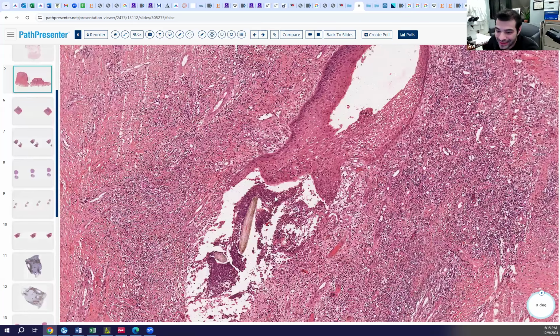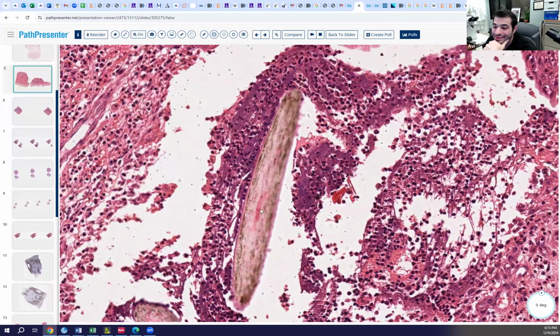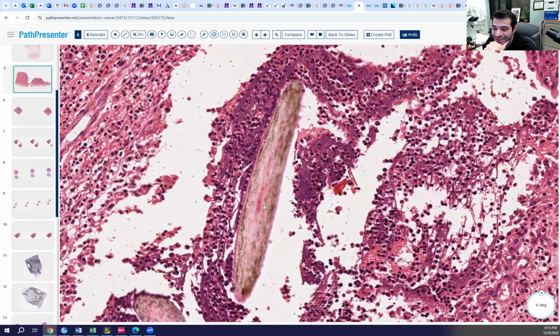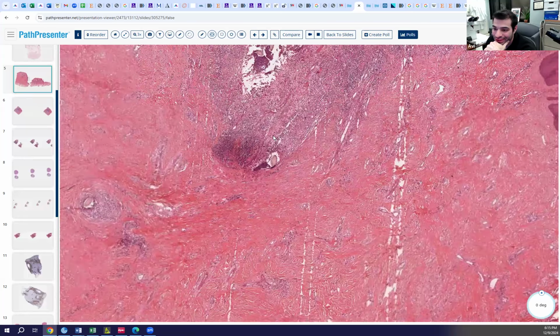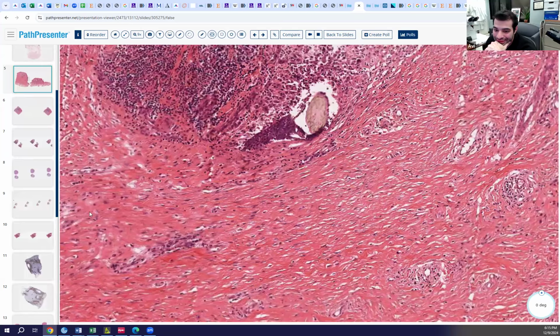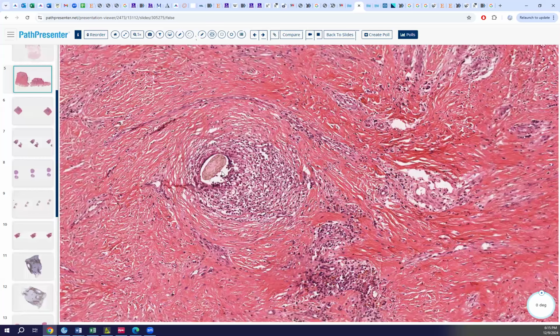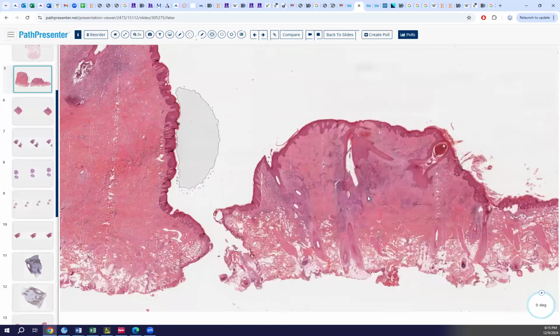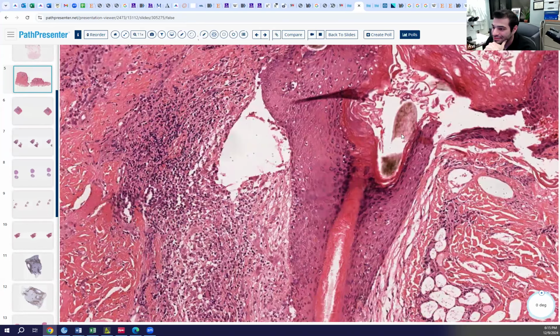Well, a splinter would be plant material. Does this look like plant material, or anything like that? Something you might see that's also here and here. No. What about here?